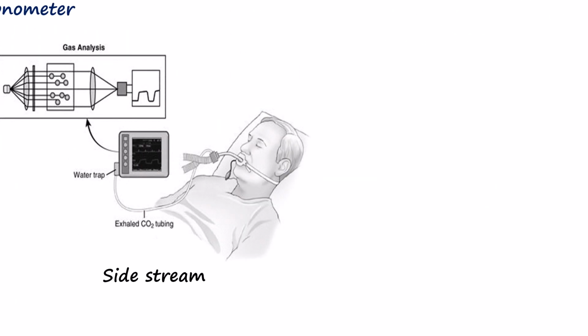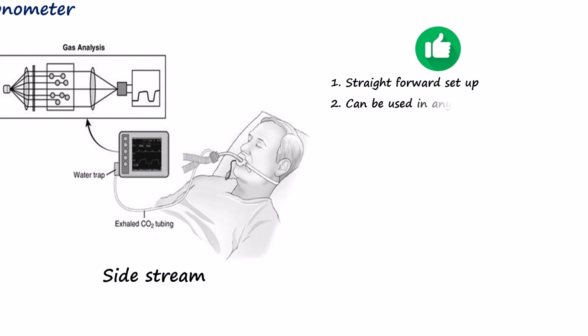Sidestream capnography offers several practical benefits. The sampling capillary tube and airway adapter are easy to connect, making setup straightforward. Sidestream capnography can be used with patients in almost any position, including the prone position. It is also suitable for use in awake patients through a specially designed nasal cannula or face mask.